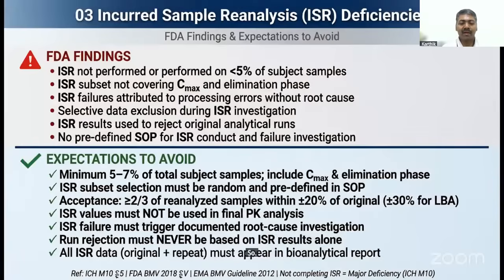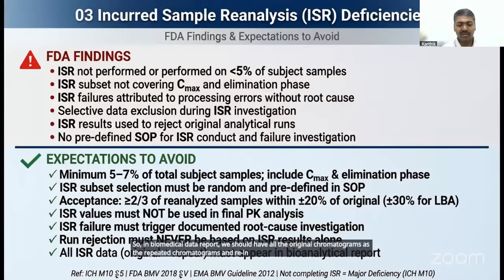So in the bioanalytical data report, we should have all the original chromatograms as well as the repeated chromatograms and re-injected chromatograms. Everything has to be covered, and no data should be hidden from the regulators.